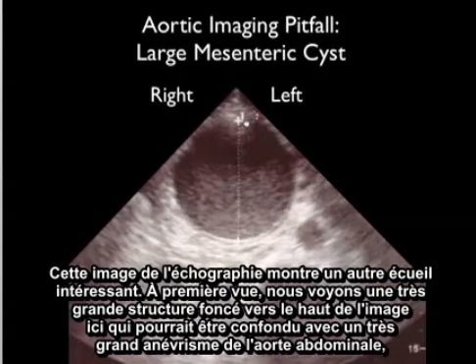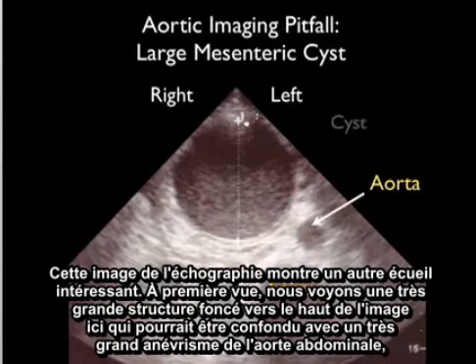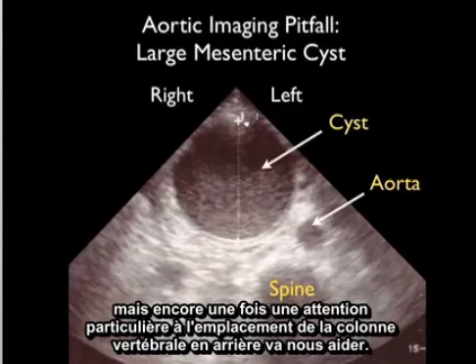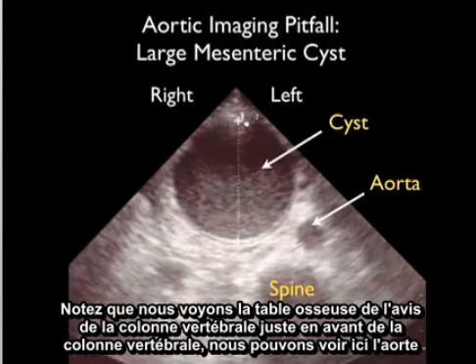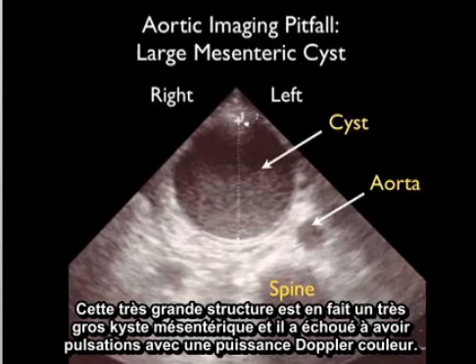This ultrasound image shows another interesting pitfall. At first glance, we see a very large dark structure towards the top of the picture that could be mistaken as a very large abdominal aortic aneurysm. But close attention to the location of the spine posteriorly will help us out. Notice just anterior to the spine we can actually see the aorta. This very large structure is actually a very large mesenteric cyst, and it failed to have pulsations with power color Doppler.